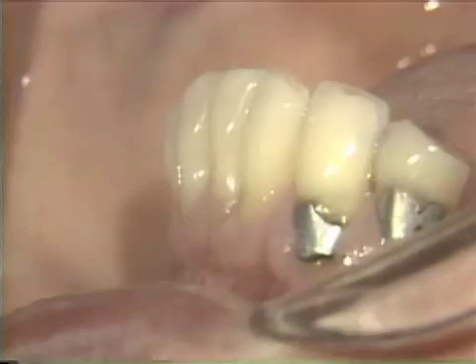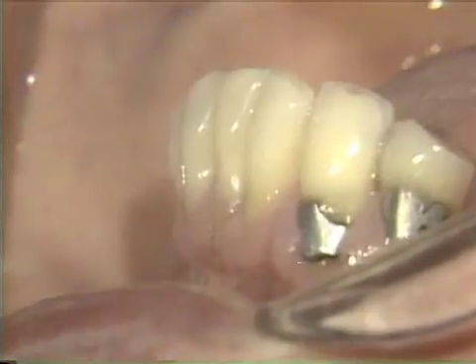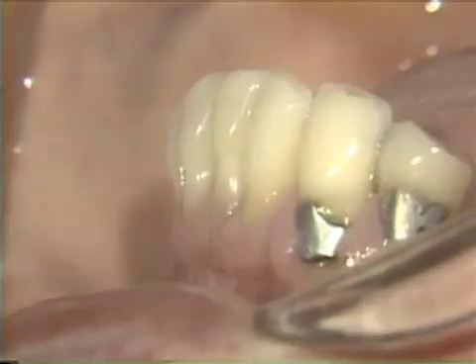Due to the unfavorable remaining support, composite recontouring will be used to balance the forces between the few remaining teeth and the less-than-ideal residual ridge.